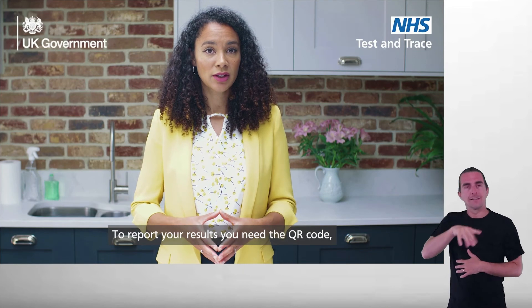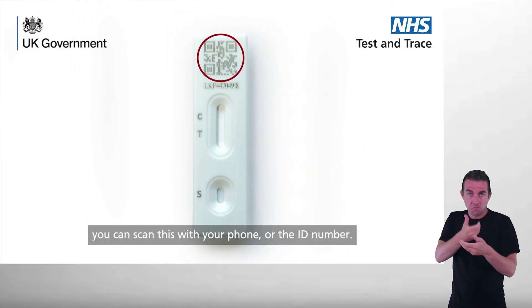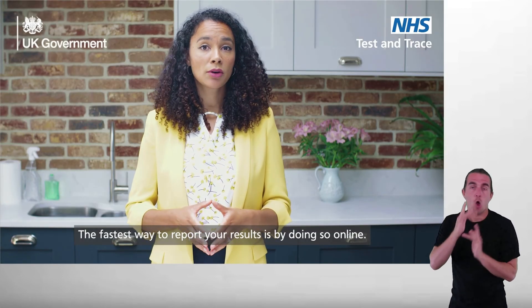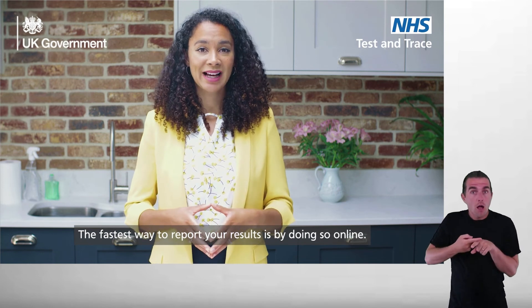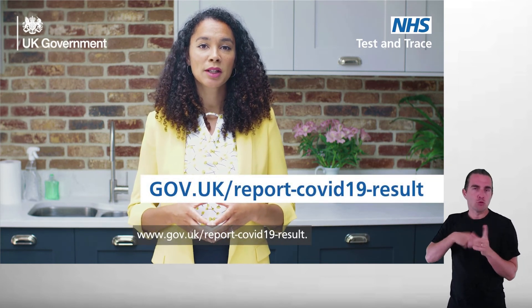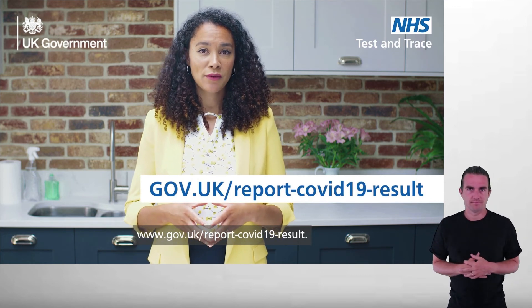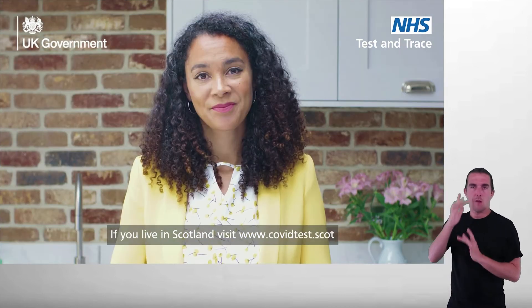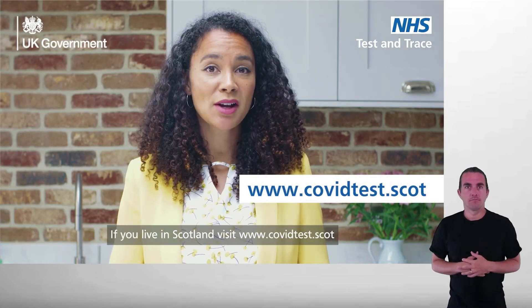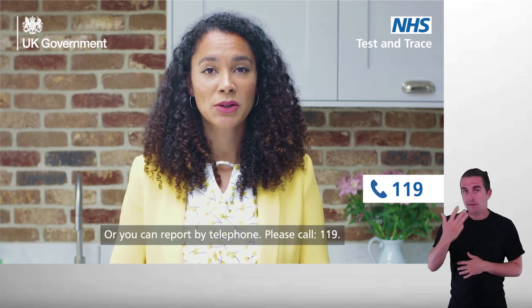To report your results, you need the QR code — you can scan this with your phone — or the ID number. Both can be found on the test cassette. The fastest way to report your result is by doing so online. If you live in England, Wales or Northern Ireland, visit www.gov.uk/report-COVID-19-result. If you live in Scotland, visit www.covidtest.scot. Or you can report by telephone — please call 119.